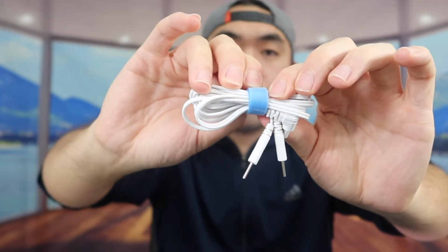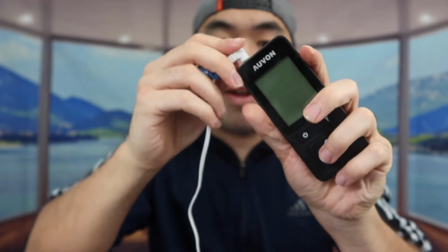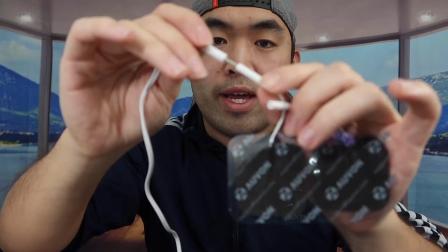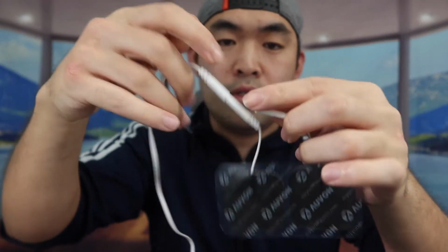So I'm going to take out one of the cables right here first. And I basically want to insert it inside right here. Once we do that, you want to insert the other side onto the two products. So one right here. And the other one right here.